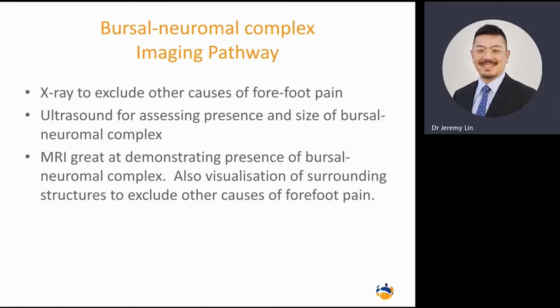Ultrasound is probably the number one modality for visualization of the bursal neuromal complex. We would be able to look for the bursal neuromal complex, assess the size, and also look for any other causes such as plantar plate tear. And also, if need be, we can often do a treatment at the same time if it has been requested on the form, where we will inject cortisone into the bursal neuromal complex to help reduce the inflammation and potentially cure the problem.